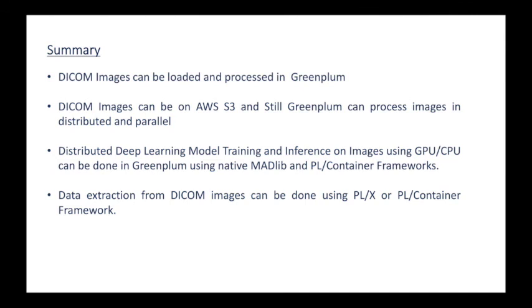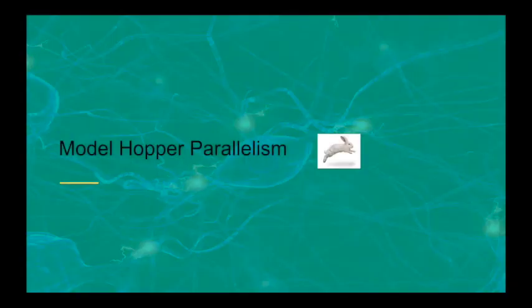PLX here stands for PL/Python, PL/R, PL/Java, something like that. So that's it.